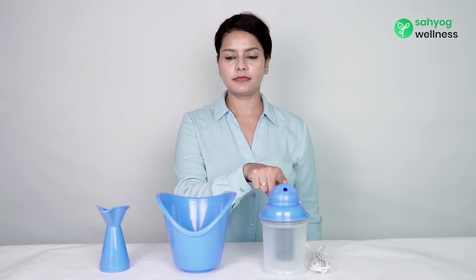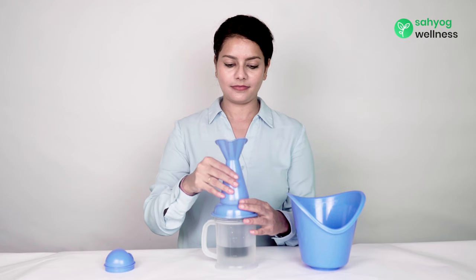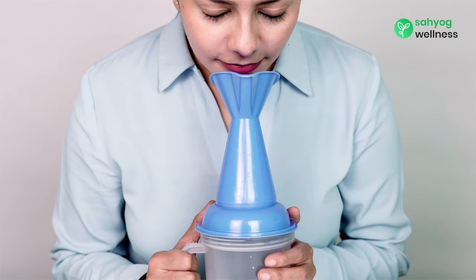There are three accessories to adjust the flow and direction of the steam. For nasal steaming, the third accessory is useful as it puts steam directly to your nose.